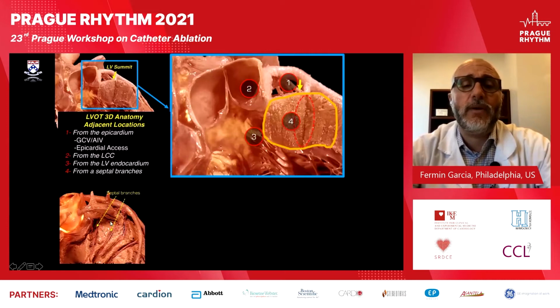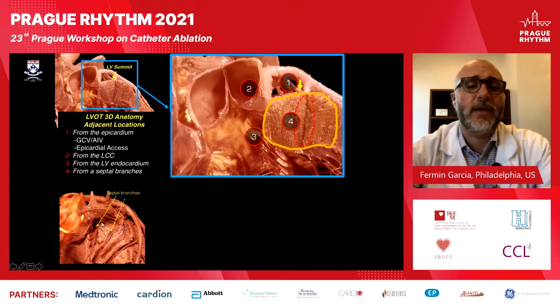What we and others recognize is that there is the ability to use the heart anatomy and the venous and arterial system to map the intramural segment. You can see here, for example, a first septal arterial perforator, and these perforators that go down on the septum.